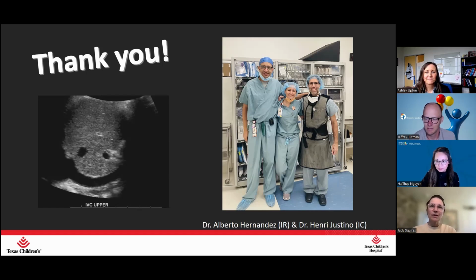We do have a few protocol automatic elastography add-ons. For example, the post-transplant patients who are getting biopsied, we combine those two tests.